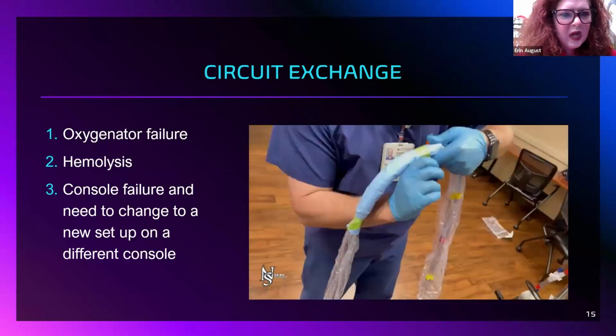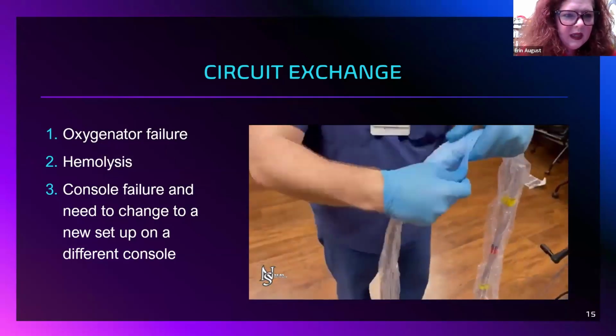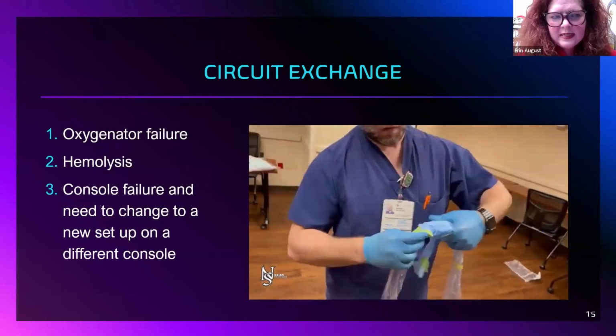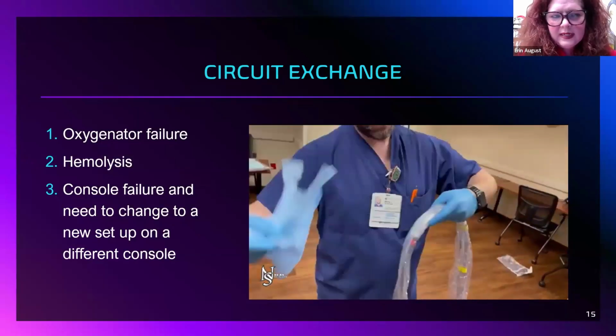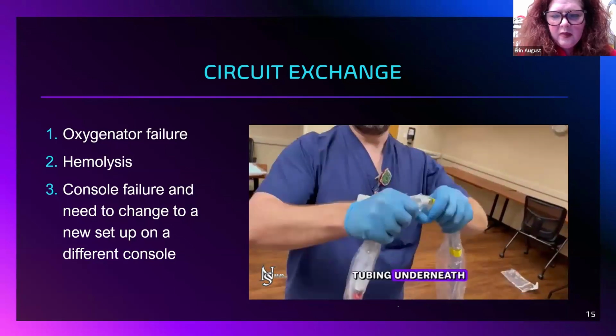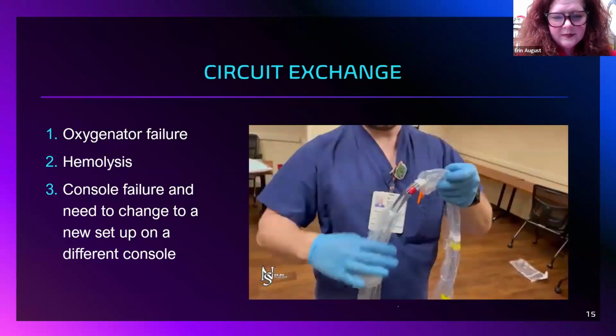Again, another good reason to practice removing this, trying to be quick and timely to get everything up to the field. Practicing how to take all these things off is extremely helpful, right? Because we know ECMO is very much attention to detail and time.